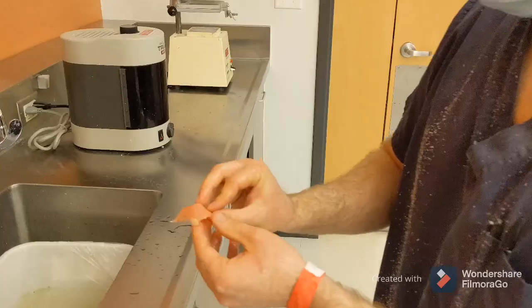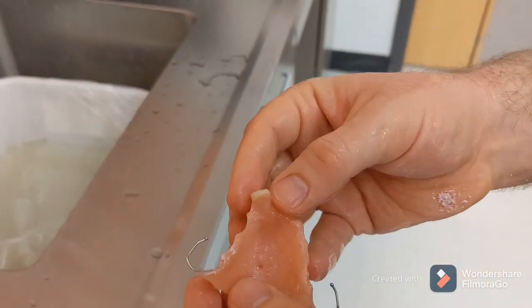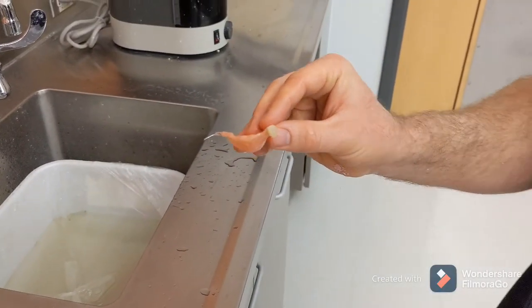We'll clean it up just slightly more. You can see it — nice and clean, nice and polished, ready to go. Way too much work.